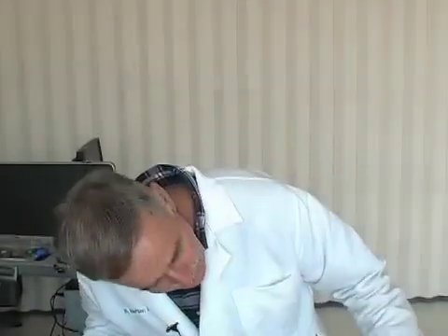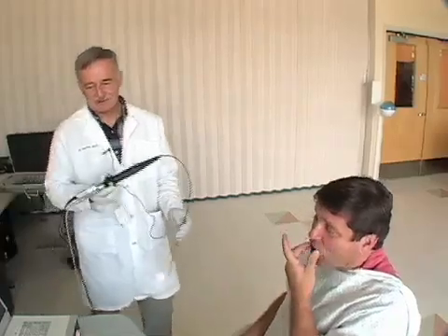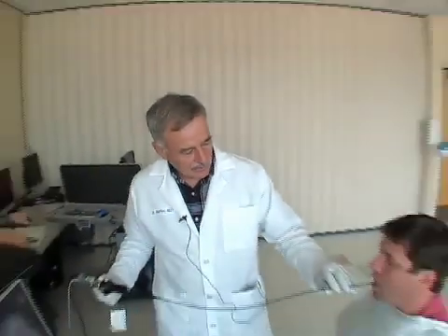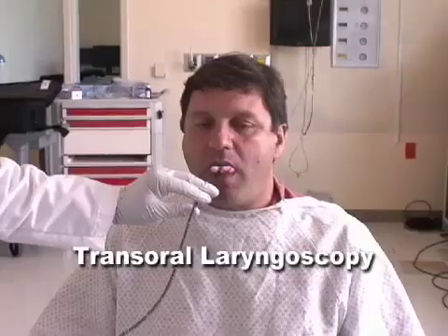I'm Dr. Napier. Dr. Berg has the device in proper position. We are now going to do direct transoral fiber optic laryngoscopy.